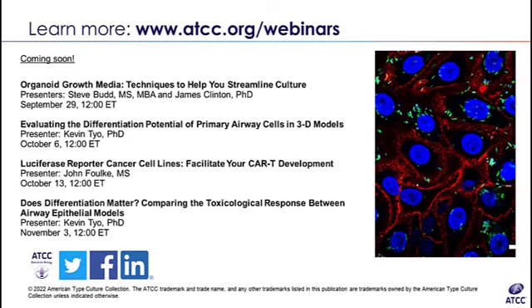Some vials, especially when you're doing a large freeze down, sometimes just may not revive well. It's kind of hard to say because it sounds like you're able to get viable cultures from the freeze down that you've done, and there are definitely a lot of factors that could be affecting recovery of the cells from different vials of the same freeze down.